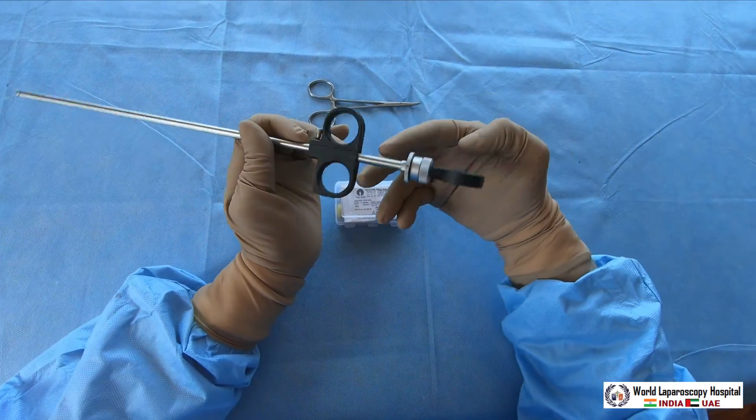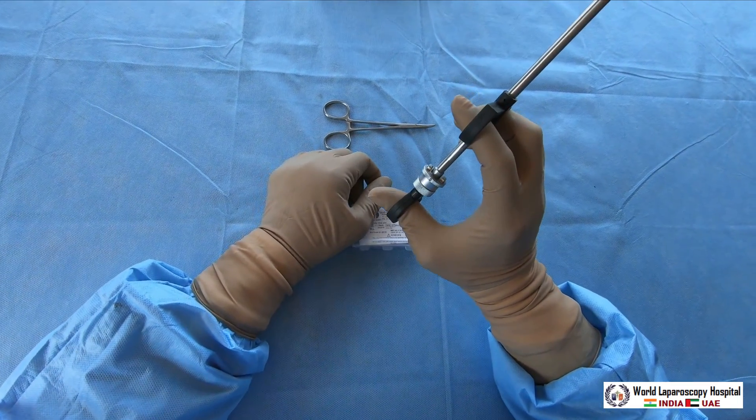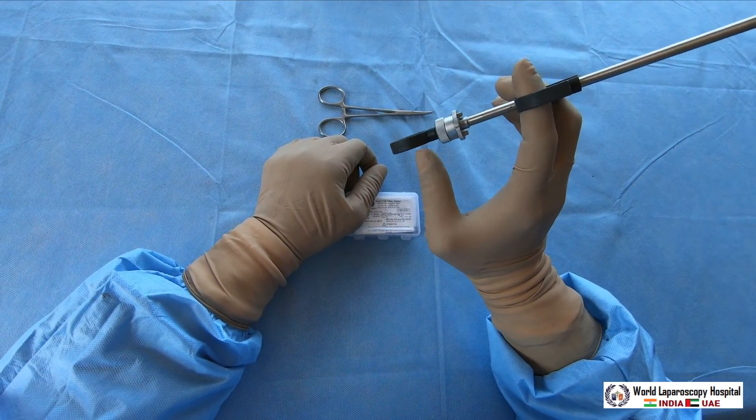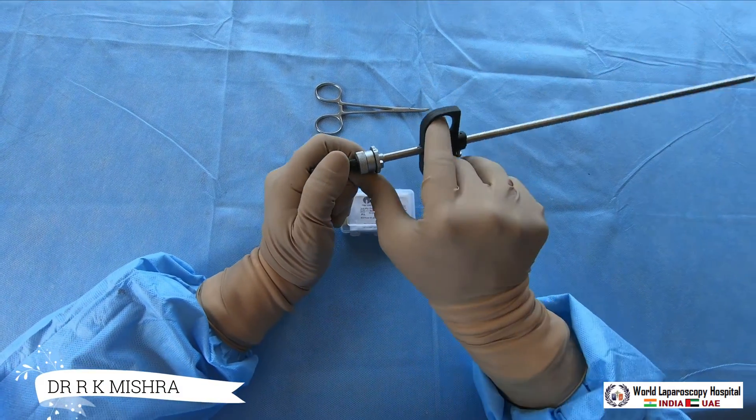So how to hold it — you should hold it like a syringe. Always hold the thumb in the back hole and these two fingers in the front hole.